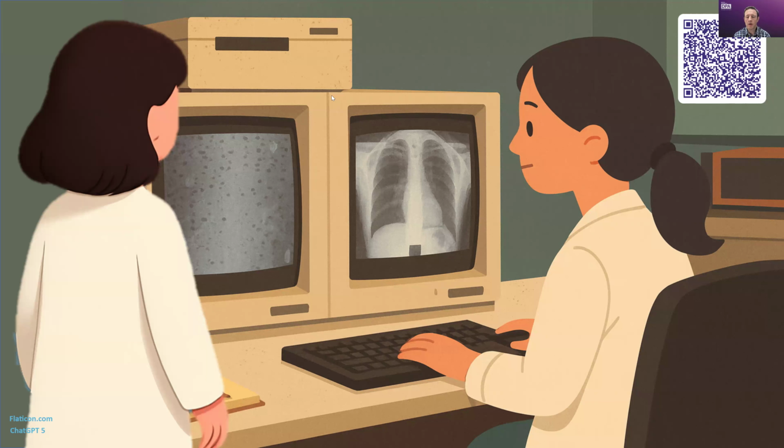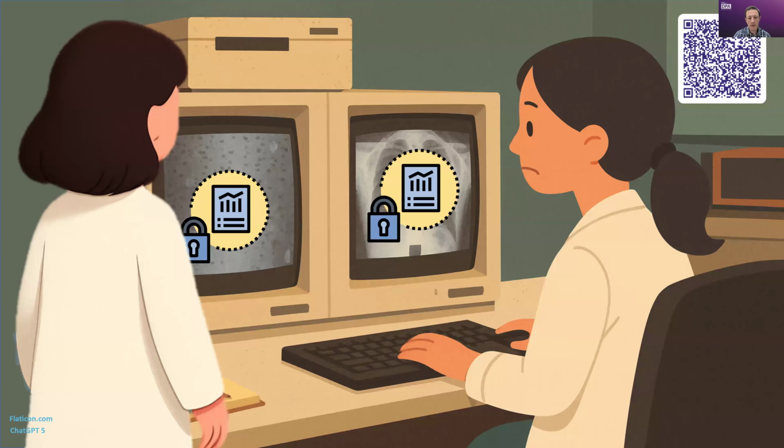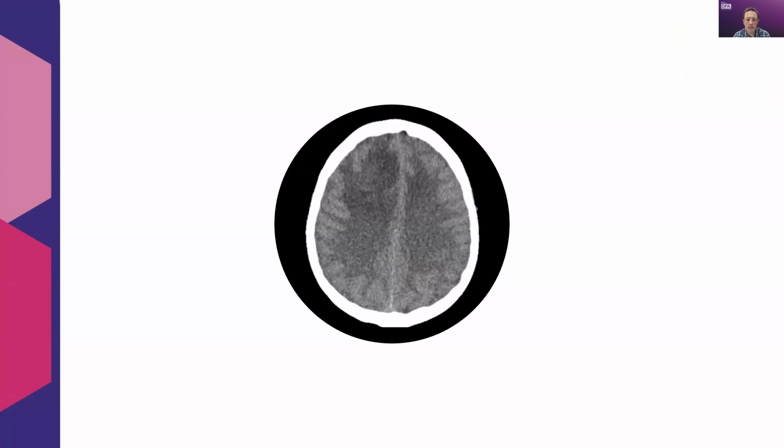I want to start with where radiology started in the 1980s. At this time, digital imaging was just being born. Radiology was moving from a film-based world to an electronic world, and that started with really expensive machines. These were MRI and CT scanners, and those machines were connected directly to computers, allowing the radiologist to view images in an electronic way as they were coming off. These tended to be proprietary formats that were submitted directly to the machines.